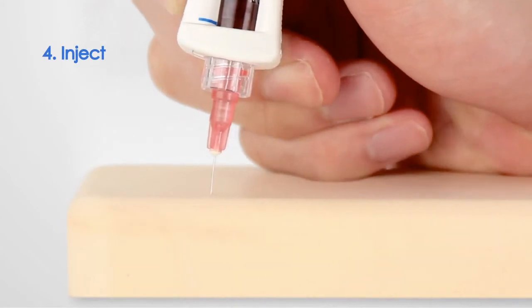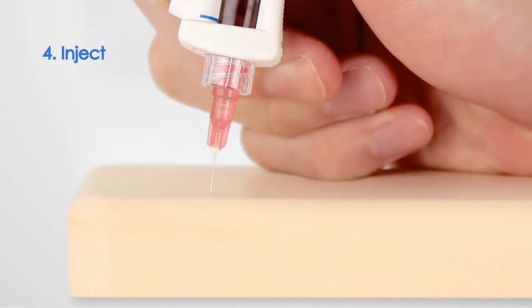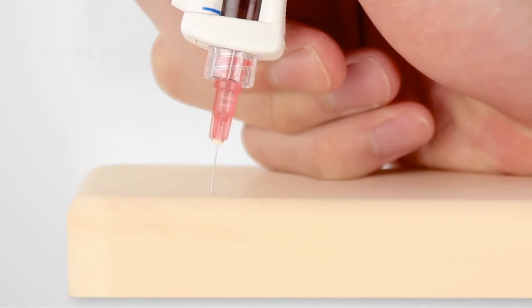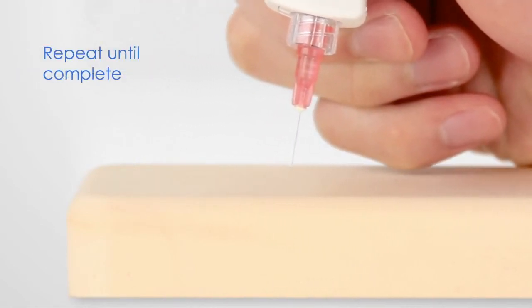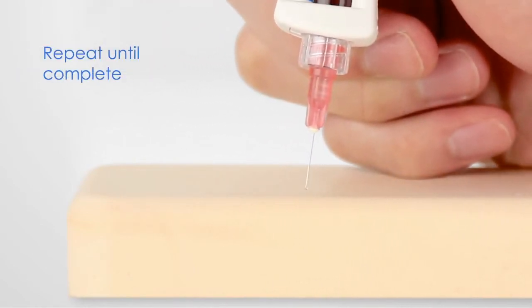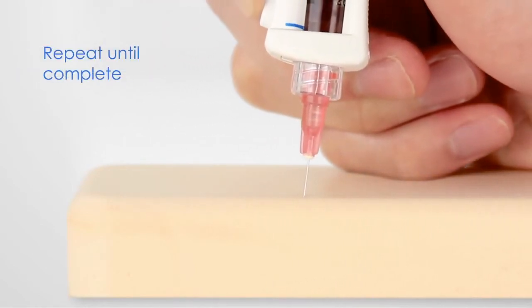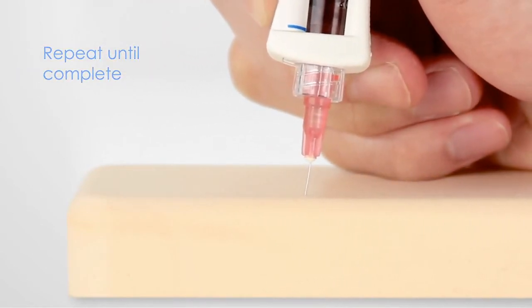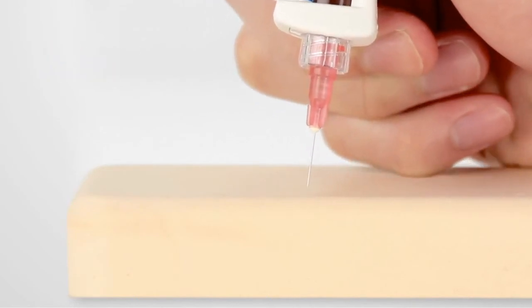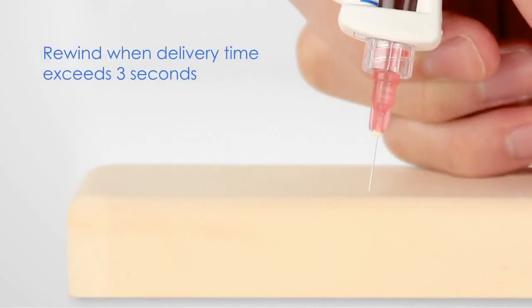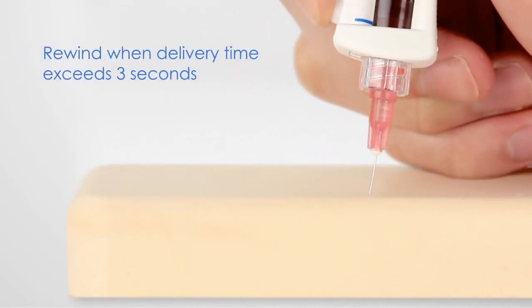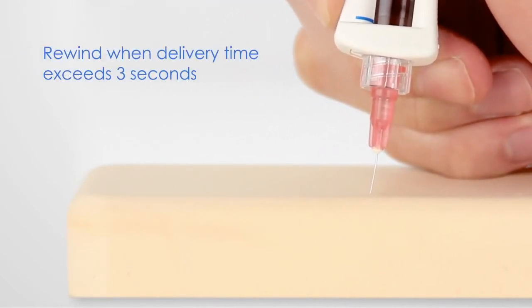An audible click signals the start of the injection and a second click signals that the dosage is complete. Continue in this way for each precise injection site. When the time between the two audible clicks exceeds three seconds, turn the load knob again.